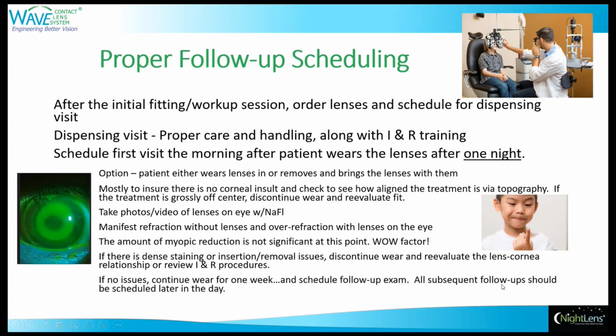But if there's no issues, the treatment is well centered, patient is seeing fairly good, continue wear for a week and then schedule another follow-up. All subsequent follow-ups after that first morning should be scheduled later in the day. This will give you an excellent idea on how the treatment is holding up as the day goes on.